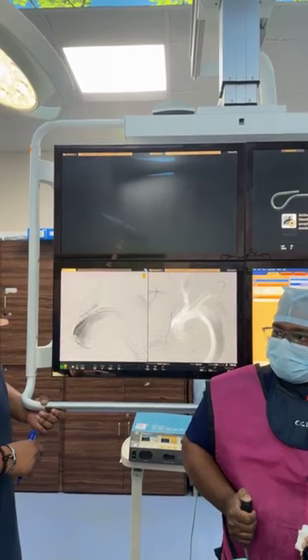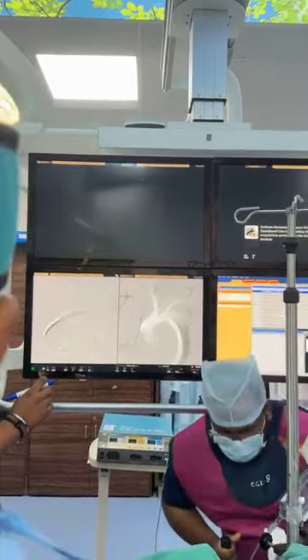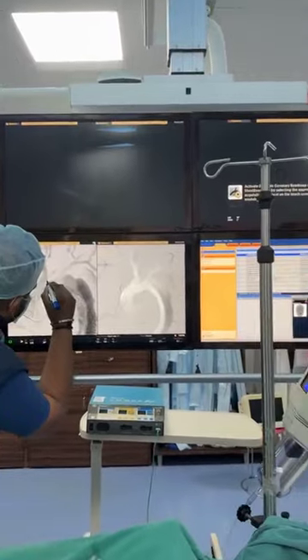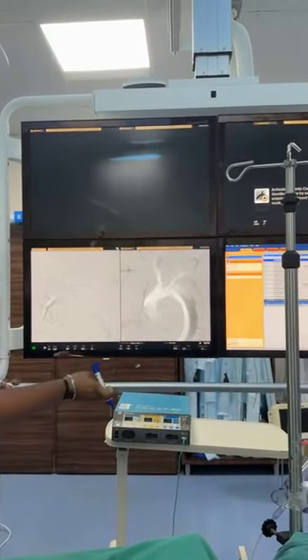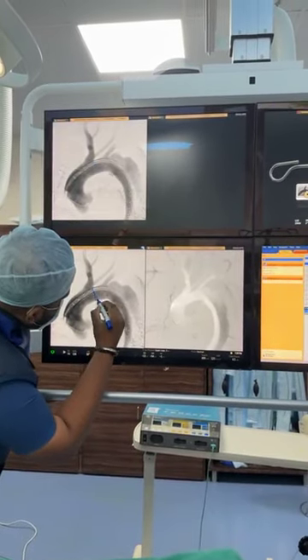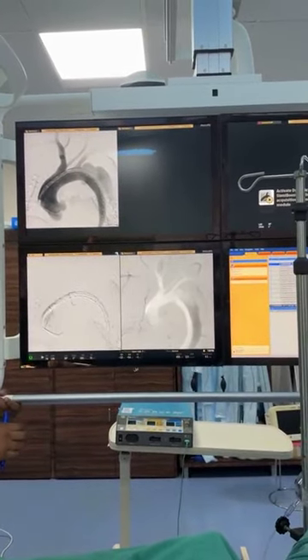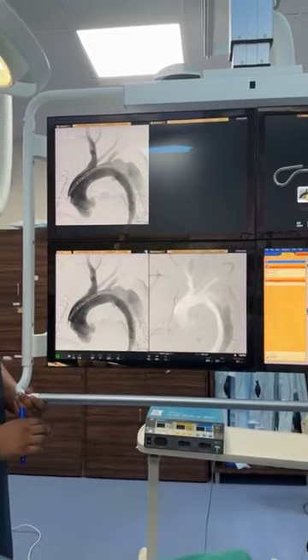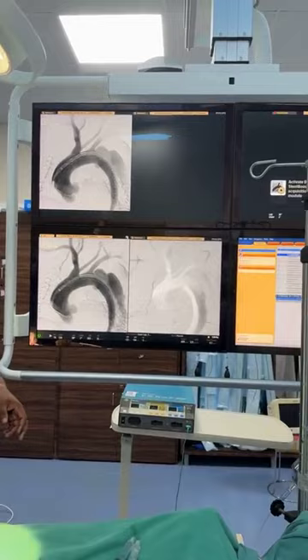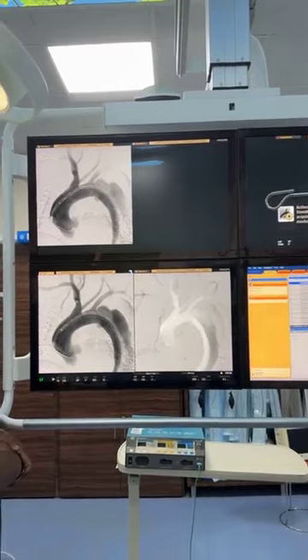Inject. Ventilate. Stop. Stop. So it has to come there. Yeah, it will. So, Dr. Prashant, could we make the systolic below 100? All right.